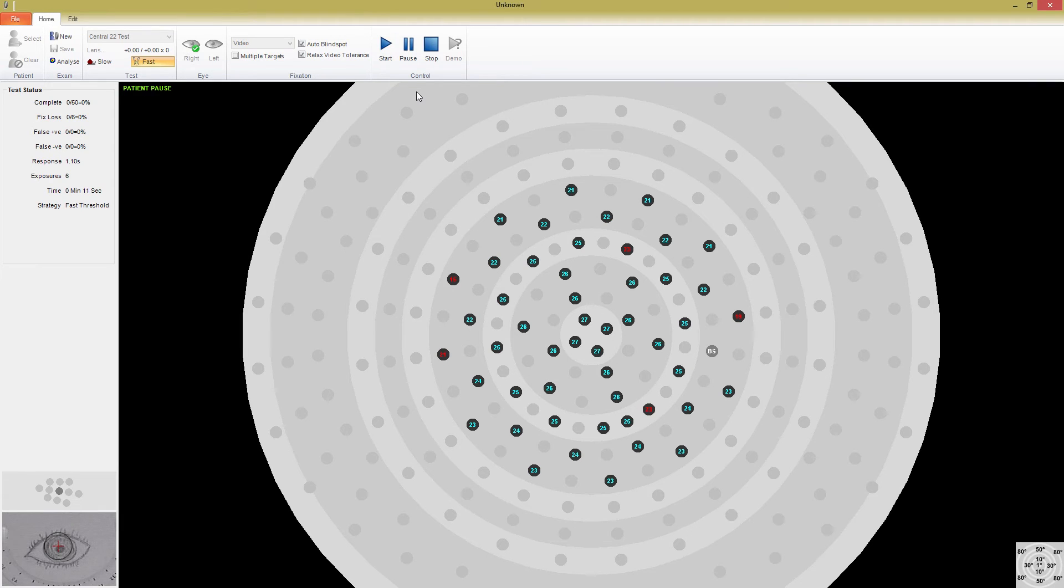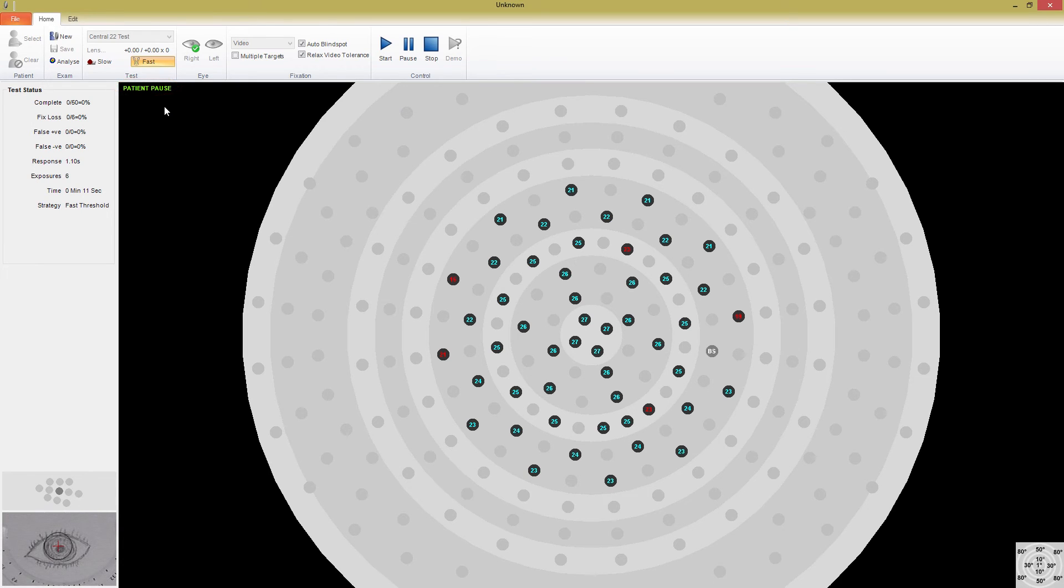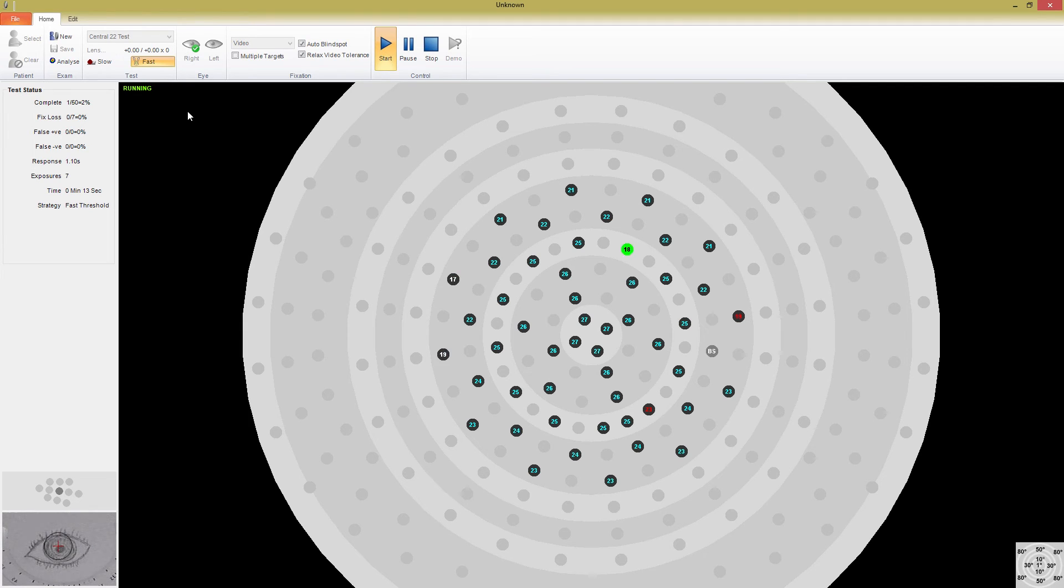Notice that in the top left there is a Test Status indicator, which displays that it is currently patient paused. Once the patient releases the patient switch, the test returns to running. You can also stop the test at any time by pressing the Stop button.